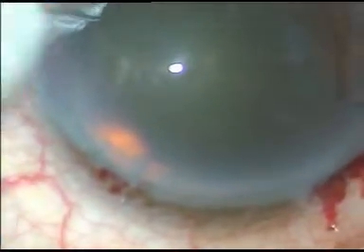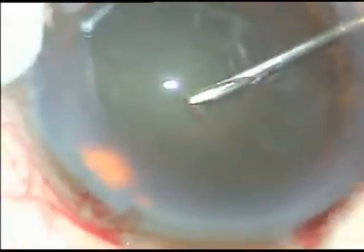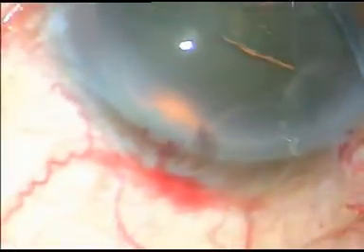Now capsulorhexis is done. With the bent cystitome, a flap is raised, and with the help of capsule holding forceps, the capsulorhexis is completed. This is a fairly round, almost circular capsulorhexis.